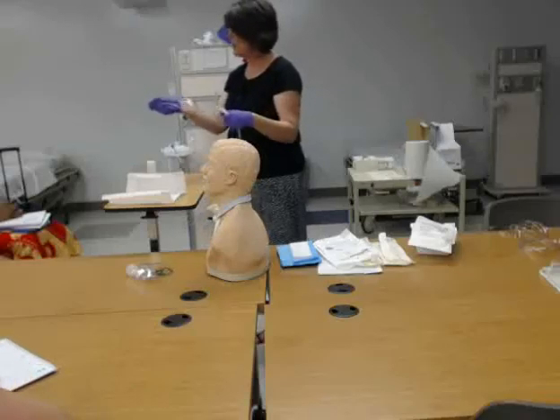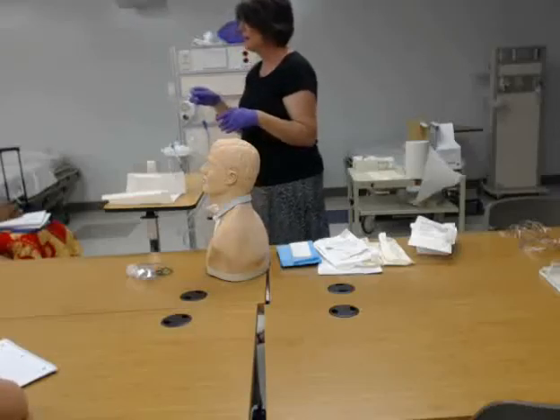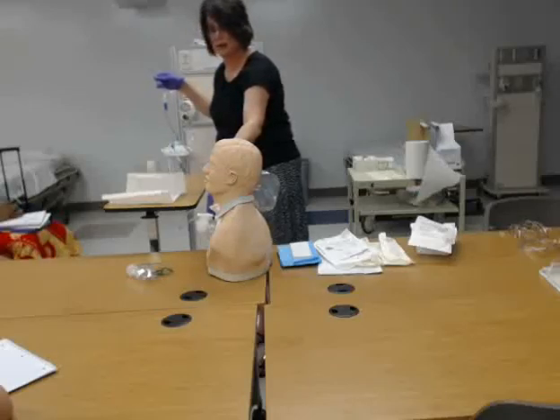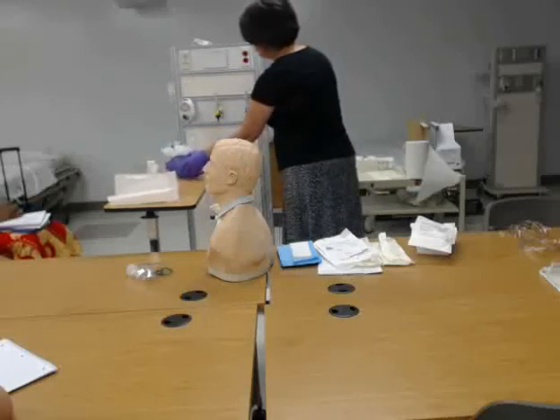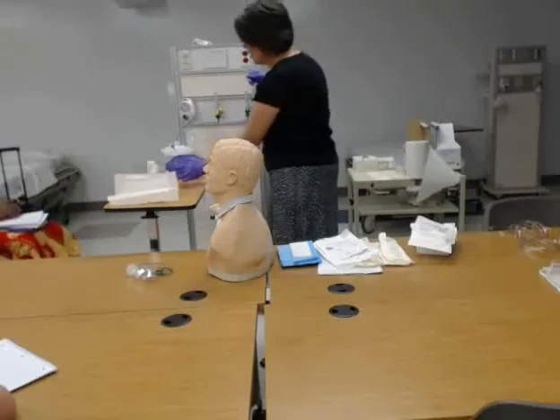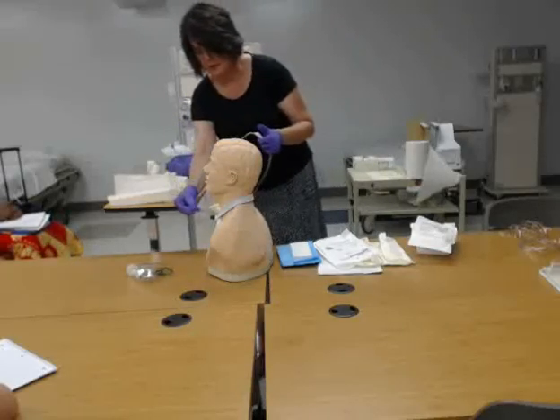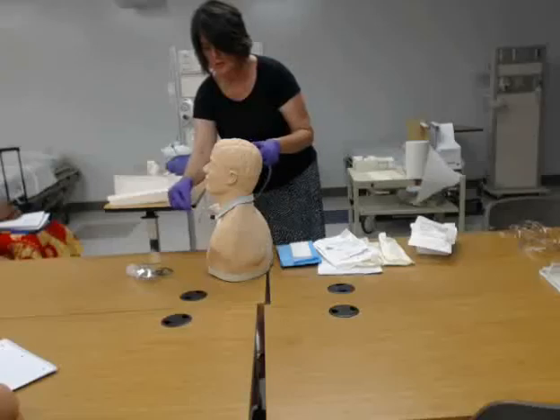I have a patient on the other end of this that I have to be constantly looking at and assessing. Maybe I feel like the patient needs a little bit of a break and a little bit more oxygen. I can always with my non-dominant hand pick up the Ambu bag, attach it to the trach, and give a few additional breaths if I felt I needed to do that — but it has to be with my non-sterile hand. If I needed to move the saline closer to me, I could do it by the bottom, since this is a non-sterile glove — I can't touch the inside, but I can touch the area that's non-sterile. And then if I needed to do it again: put it in, reach the bifurcation, pull out half an inch, and then in a circular motion go ahead and suction.